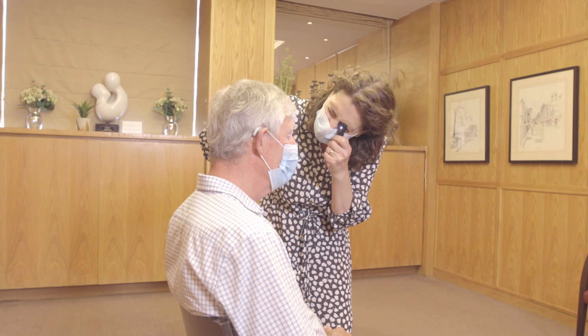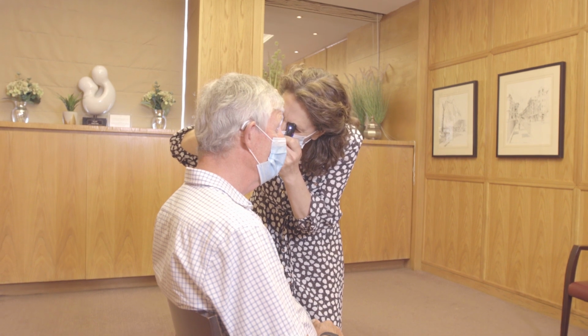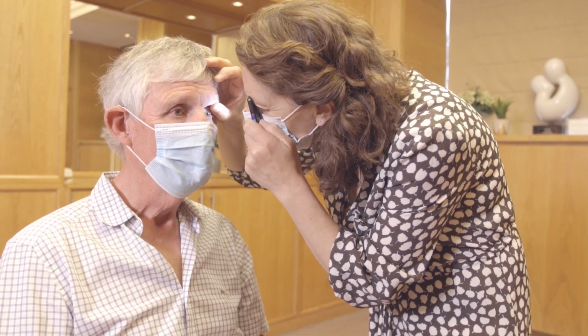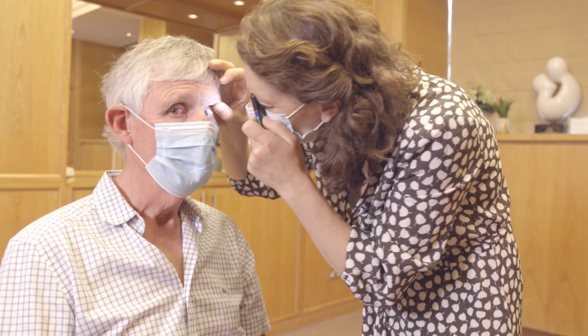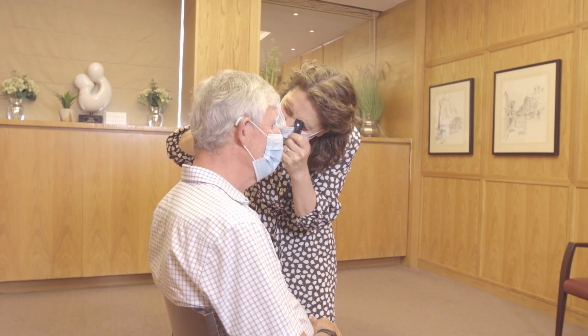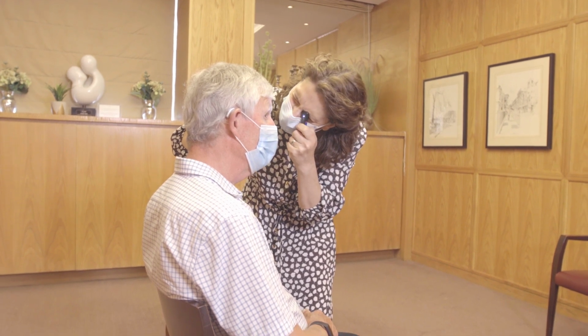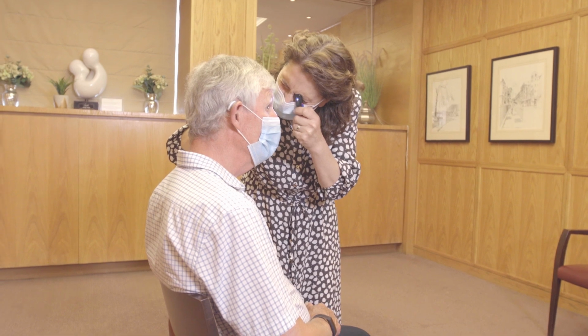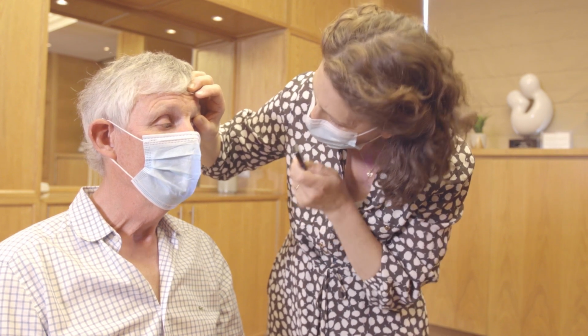The patient is asked to look into the distance with the eyes slightly elevated. The right eye of the examiner examines the right eye of the patient, and the examiner's left eye is used to examine the left eye of the patient. With permission, the examiner rests the hand, not holding the ophthalmoscope, on the patient's head to provide stability. The upper lid of the eye being examined can be elevated with the thumb of the same hand to provide good access to the globe.